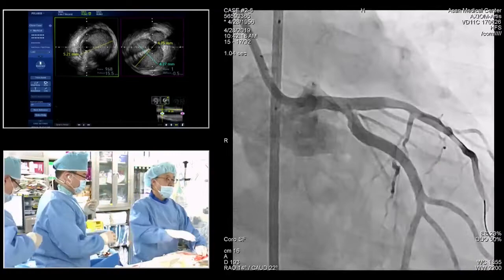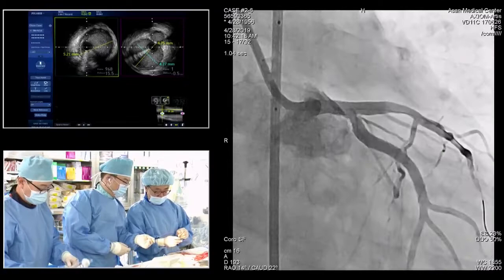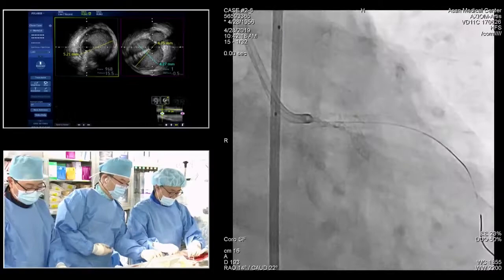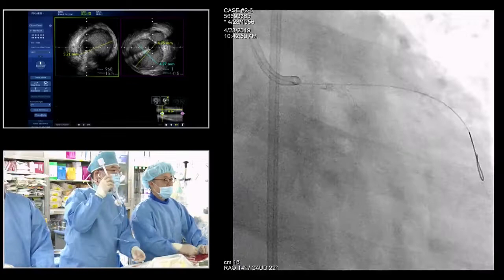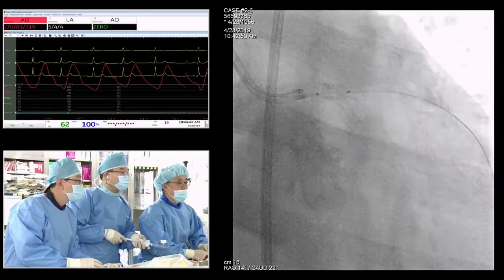And you know, wire recrossing is definitely important to prevent wrong direction wire passage, or to facilitate wire recrossing much more easily. Right, and the POT really helps with that. Yeah, definitely. Okay, this is 4.5. Okay, got it. Okay, go. 4.5 is good. I think you could have done a 5.0 if you wanted.